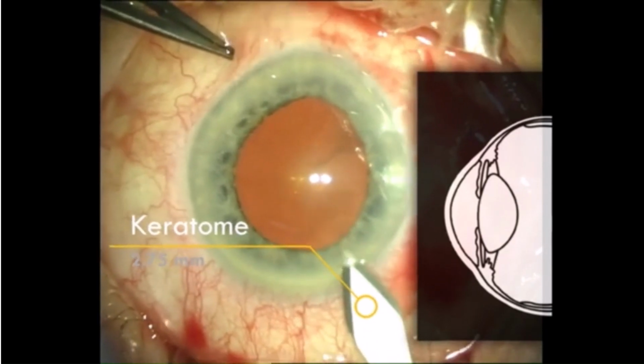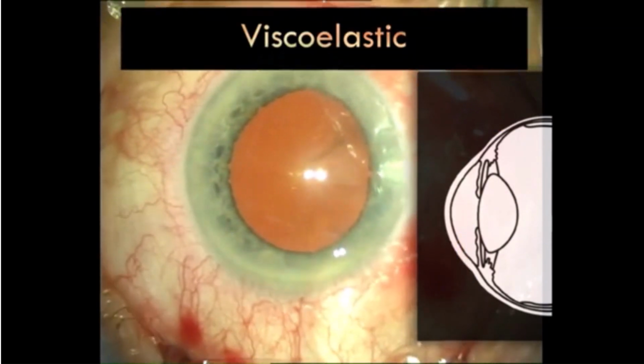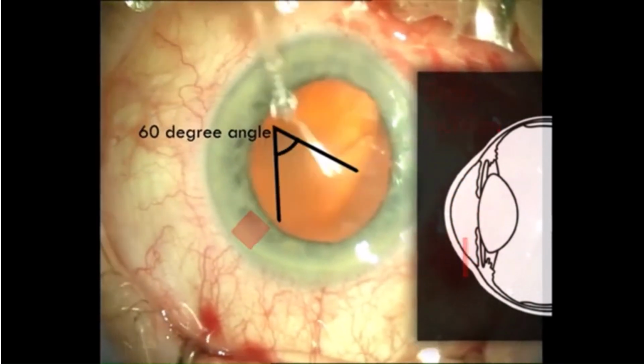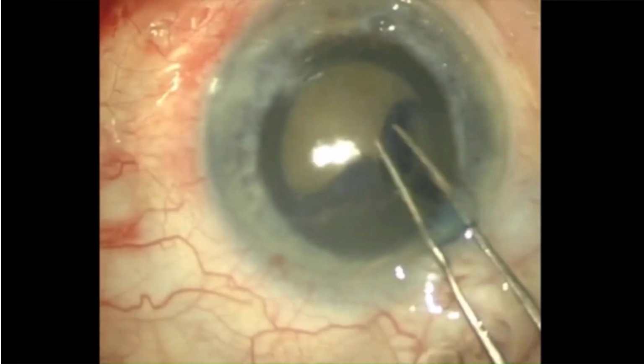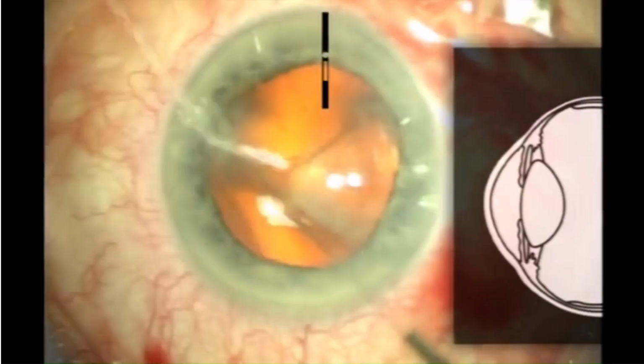So the tiny 2.8 mm corneal incision is made with the help of a keratome, and a side port incision for manipulation. Now here, just to make you understand, the capsule has been stained. So see, that's a CCC being done with the help of a utrata.